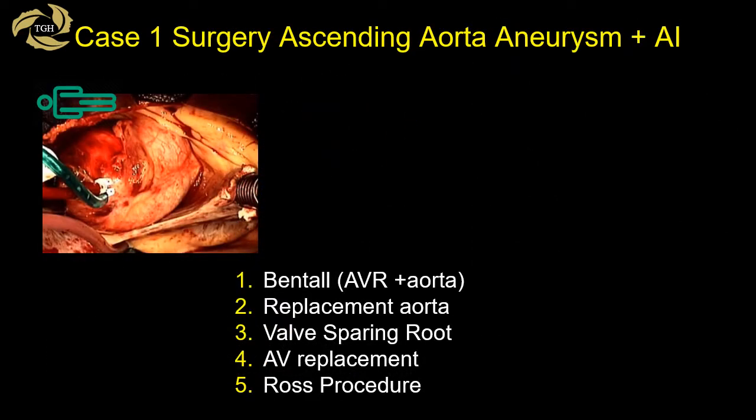The ascending aorta and STJ are dilated with moderate AI from central malcoaptation. The surgeon must address the ascending aorta dilatation and reduce the amount of AI. Options are to just replace the diseased aortic segment, the entire root, replace the valve, replace the root, and ascending aorta.